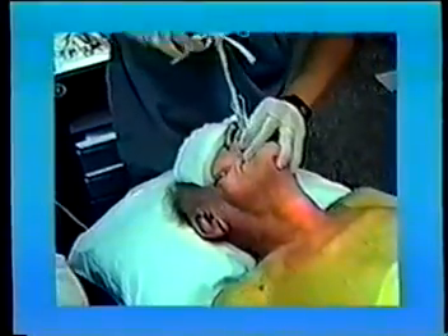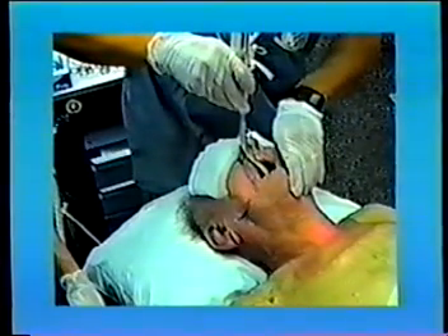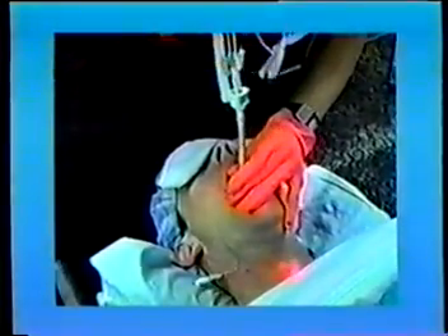Retracting the stylet more than 10 centimeters is not desirable because it limits your ability to control the tip of the tube. If the tube hangs up, while maintaining a gentle inward pressure, move the handle 90 degrees and return it to vertical — this generally allows the tip to find its way through the cords. When the tip is just beyond the cords and the stylet has been retracted, be sure to again lift the tongue and jaw, which lifts the back of the tongue, allowing the tube to be easily advanced. Intubation of awake patients can be readily accomplished with the TrachLite provided that appropriate topical anesthesia has been applied.